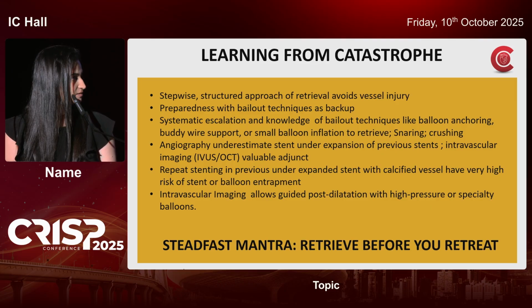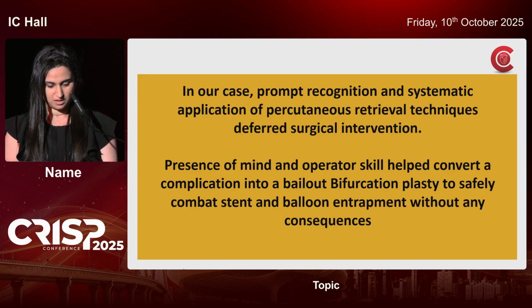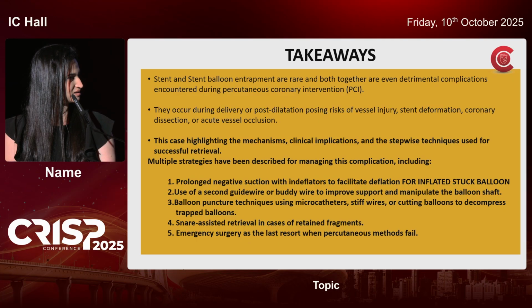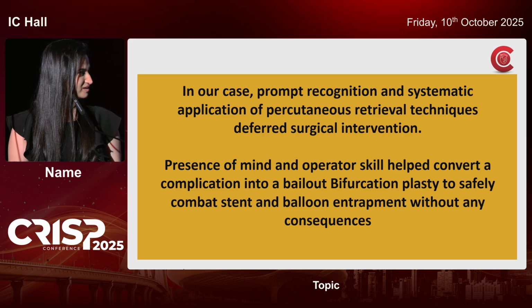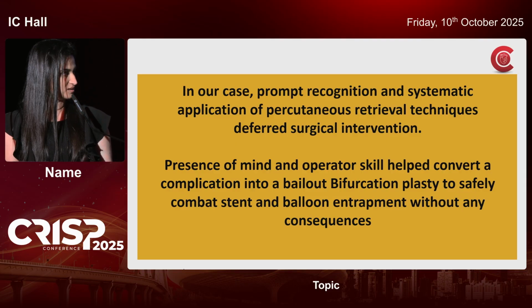Do you have the last shoot? Because you didn't show the final result, it was just a stent boost image. We want to see what actually happened to that circumflex stent. I don't have the last shoot at this moment. I think it's the most important shoot actually. Why did all this happen? Sir, what do you think is the cause?